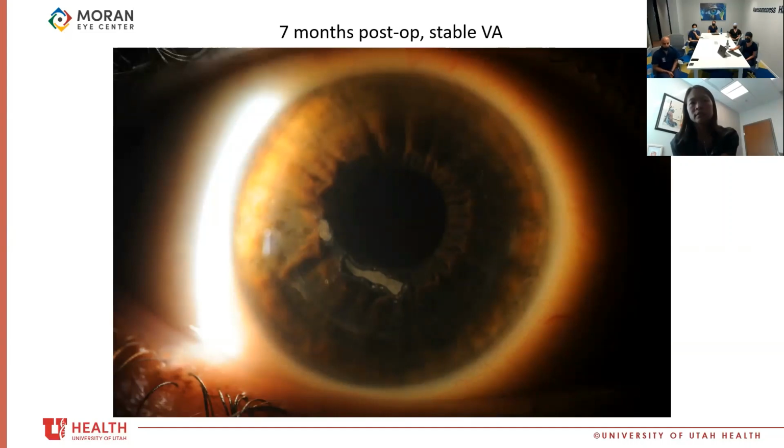Yeah, that's a tough case because I guess it's been lifted a few times before you got to it, right? So it's always hard to know what's happened exactly. I have used alcohol, 20%, and in your situation, it was really tough to get this patient to cooperate to fully do the treatment. But as you mentioned, doing the underside of the LASIK flap, and then alcohol on that, and then on the stromal area, alcohol on that.